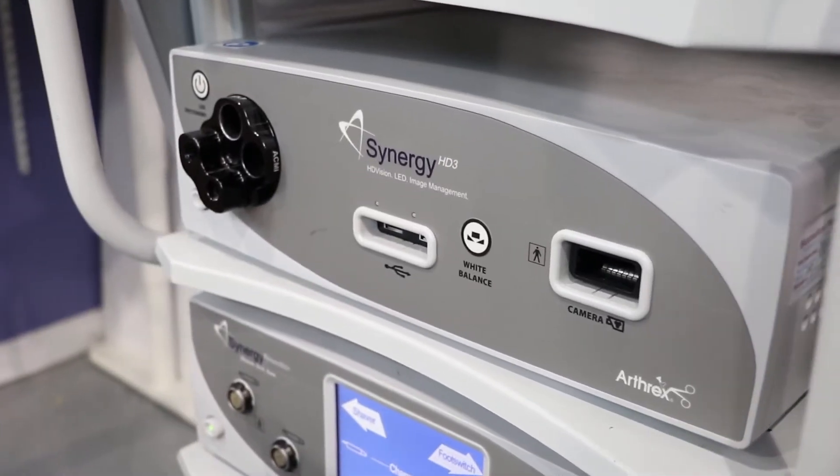Hello, this is Michael with AA Medical Store. Today we're going to focus on the Arthrex Synergy HD3 system.